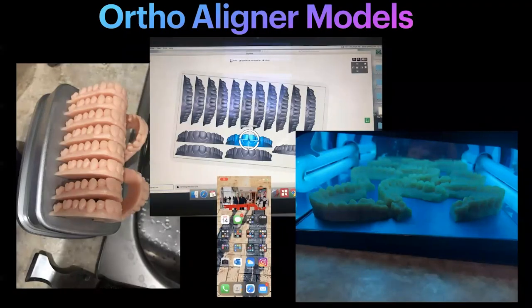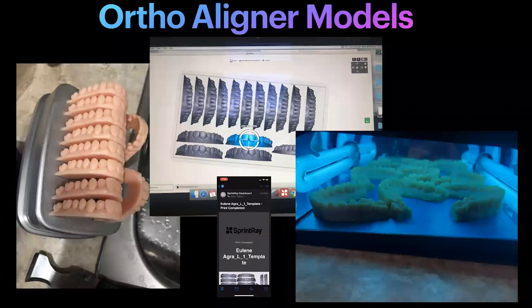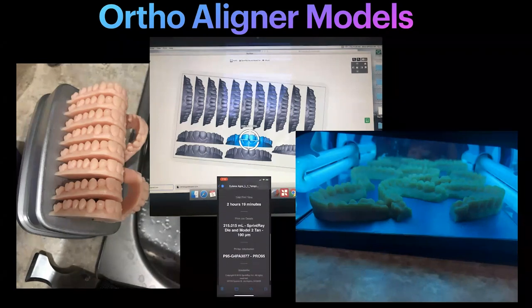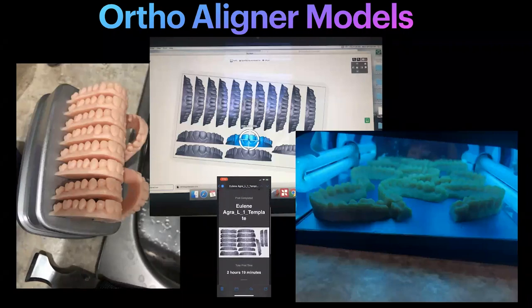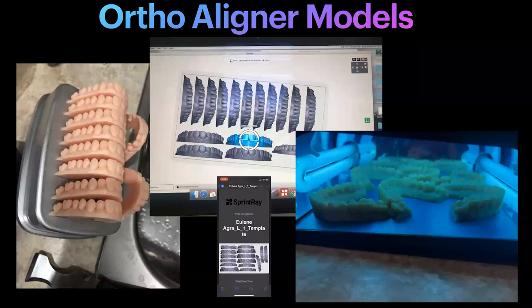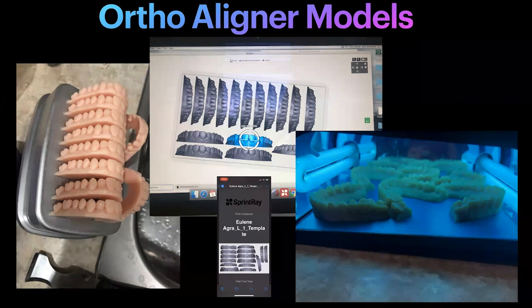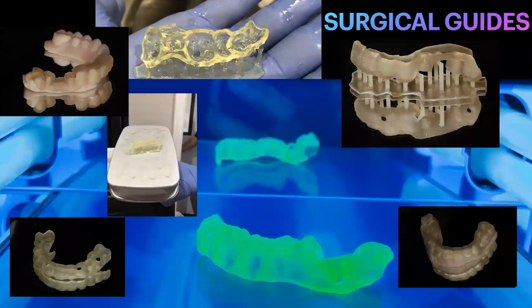Ortho aligner models — you can print in volume and create your ortho aligners in-house. I love Sprint Ray with Dashboard — it's integrated. I get an alert and an email when the print is done, and on the phone I can see the total print time for all models on a vertical print. Our orthodontists use Spark software with Ormco and can scan, plan, and 3D print models to start an aligner same-day treatment. You can also build a job at home, VPN in, send the print, and get the email when it's done. You show up the next morning and all those are done — you're not waiting two hours.